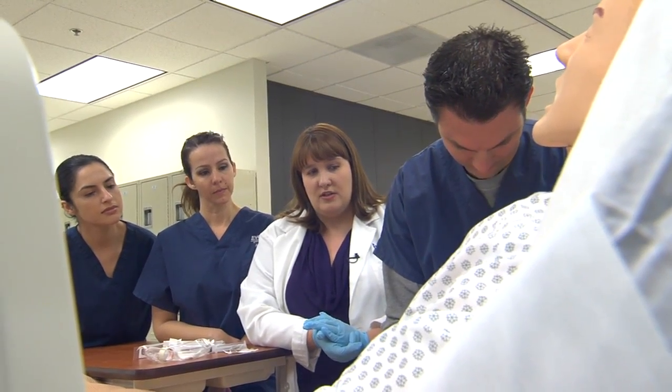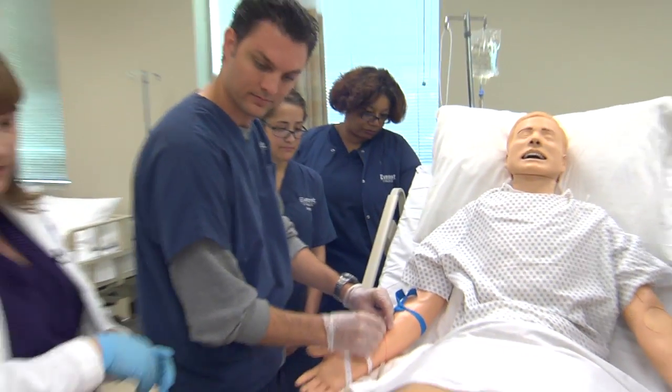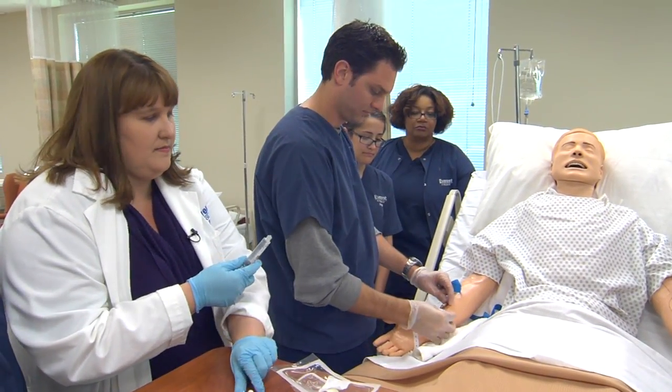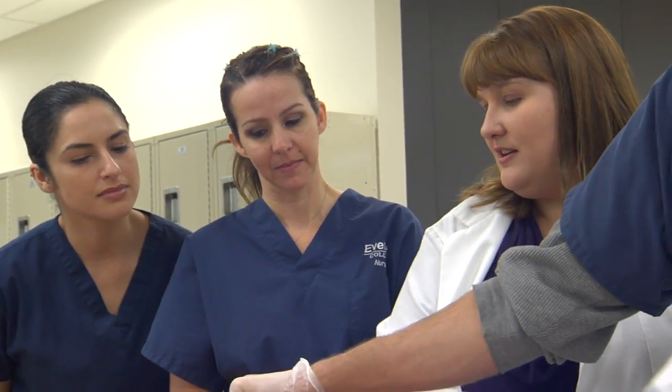Hold over the vein to put the safety on. Release the tourniquet. And then he's going to flush it.